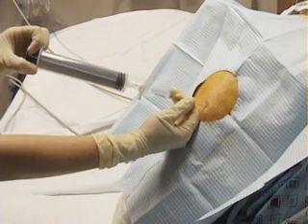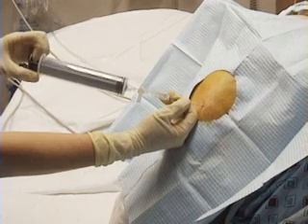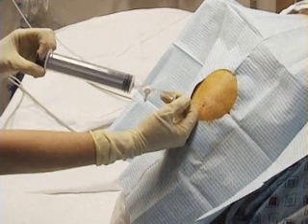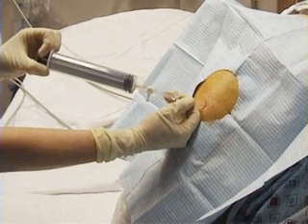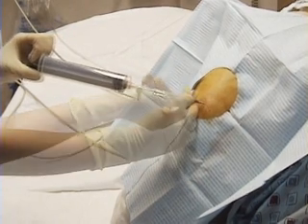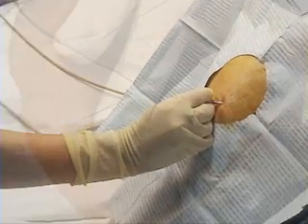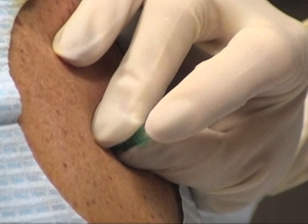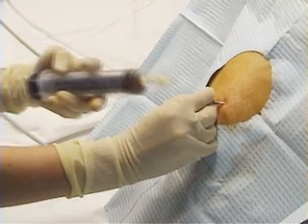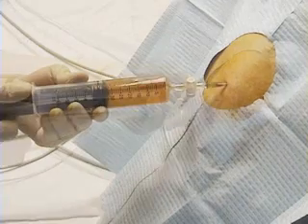Attach an 18-gauge over-the-needle catheter to a syringe and advance it along the superior surface of the rib. Keep pulling back on the plunger as you proceed to the predetermined depth of the pleural space. Once fluid is aspirated, immediately stop advancing the needle and guide the plastic catheter over the needle. When the catheter is fully inserted, remove the needle as the patient exhales or hums. The exposed hub of the catheter should be covered immediately with your finger to prevent the entry of air into the pleural space. Next, attach the three-way stopcock and large syringe to the catheter and continue to aspirate fluid.